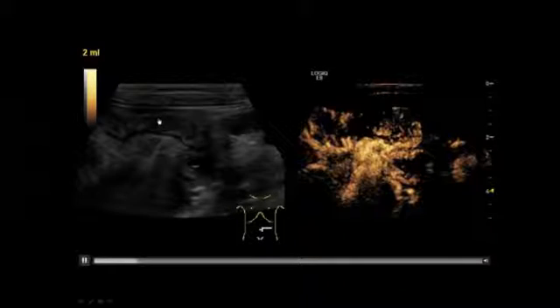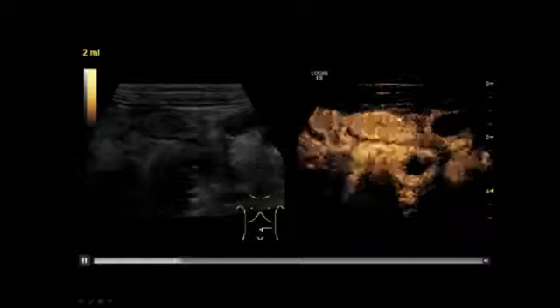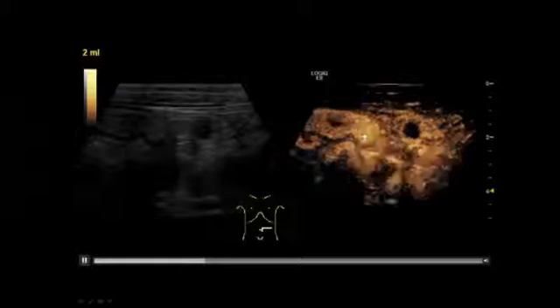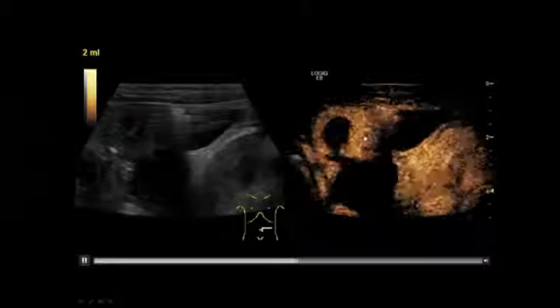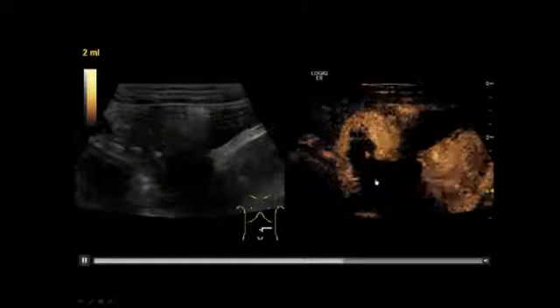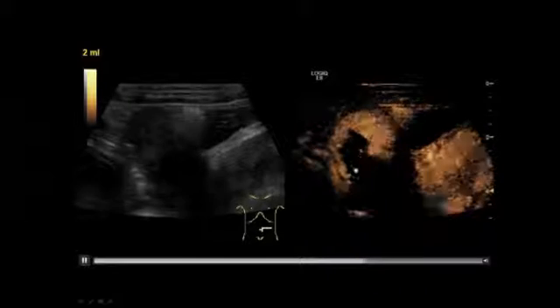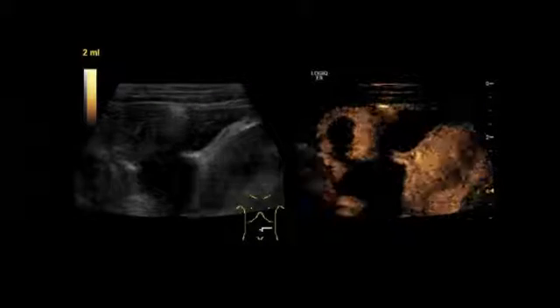So now you see the small bowel, and you see that some segments really show a hyper-enhanced wall, like this one, compared to this one in the neighborhood. And also what's easier with the contrast is to follow: are there any inflammatory stenoses? So here, for example, you see an enhanced wall, and you see the fluid within the small bowel going ahead, and then you can much more easily follow where this inflamed bowel wall is going to, and how is the peristalsis in this.